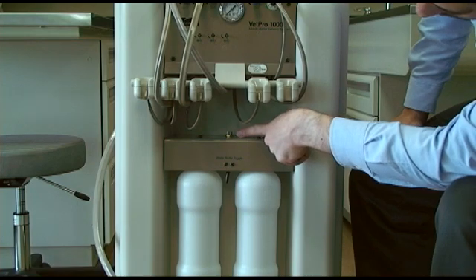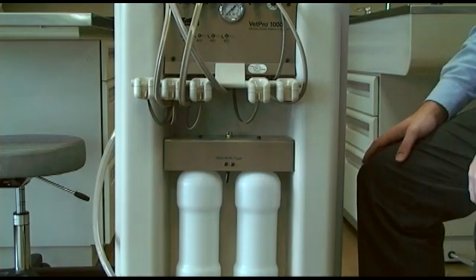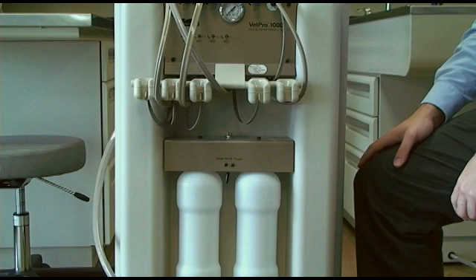Behind these bottles is a knob for the water regulator, which is used to control airflow to the water bottles. The regulator is set to 40 psi and does not need to be adjusted.